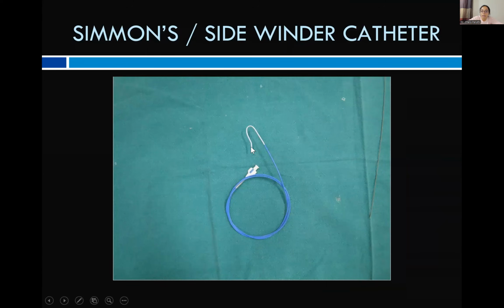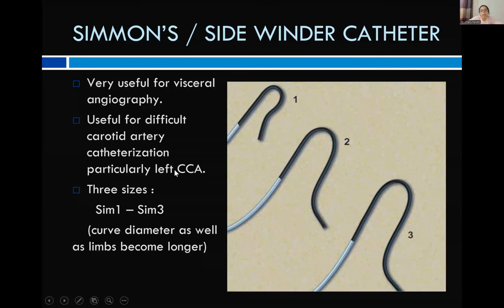This is a Simmons or a sidewinder catheter. So this is a reverse curve catheter, and the uses of this catheter are usually in hooking visceral arteries in angiography, in doing spinal angiograms, or when we have a difficult arch anatomy, like a bovine arch or a type 2 and type 3 arch, when the vessels are originating at an acute angle. Then depending on the diameter of the secondary curve, it is of three types: Simmons type 1, Sim 2, and Sim 3. The diameter of the secondary curve keeps on increasing as the Simmons number increases.